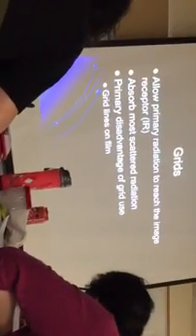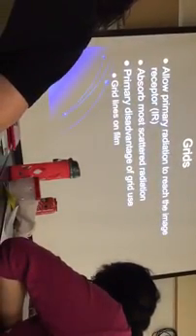And the other disadvantage is that you have to increase patient dose. Because there's going to be more absorption, you're going to lose some of the density, so you have to increase technical factors, and so the patient dose increases. Okay, and so here we go. So this is the idea.